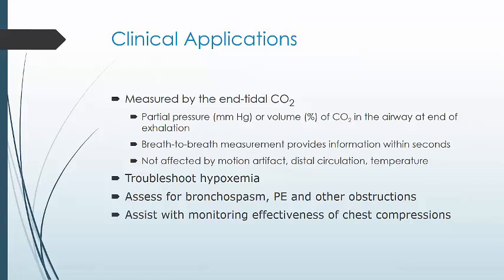It's not affected by motion artifact, distal circulation, or temperature, like pulse ox can be. Of course, if the patient's talking, that will affect it with some artifact, but generally the actual mechanism of breathing is not going to create any weird artifact. We can use this to troubleshoot hypoxemia. We can look for bronchospasms, PEs, all kinds of things.